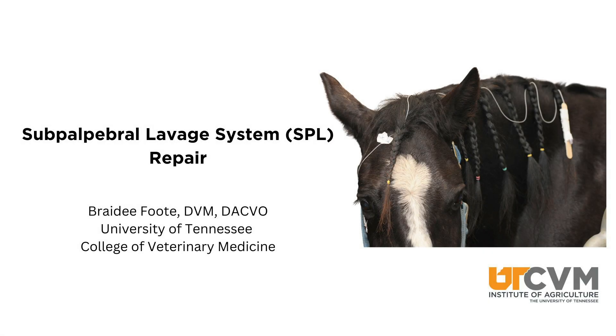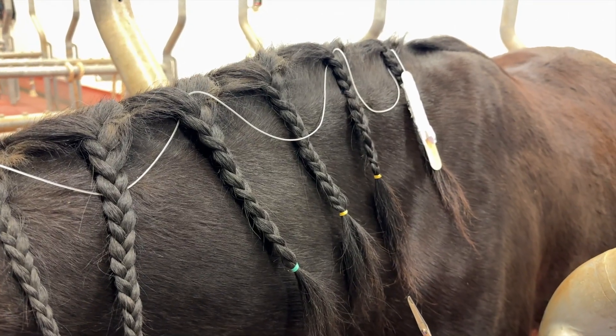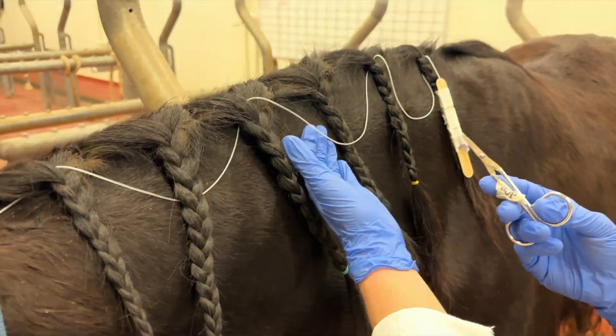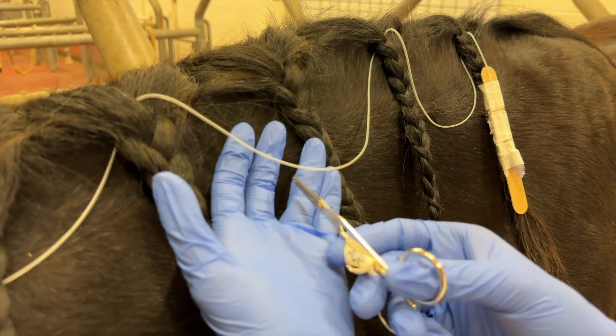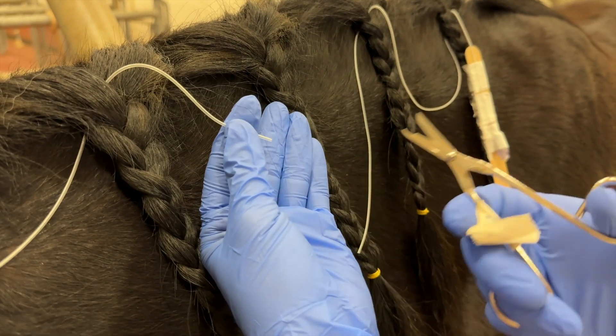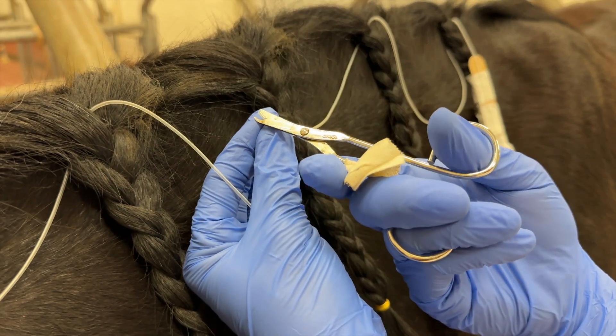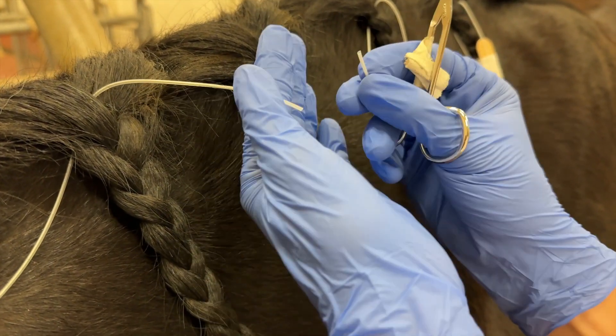This is the sub-palpebral lavage repair. You may need to repair the line if you get a bubble or a hole within the line. You just need a clean pair of scissors and you're going to cut out the damaged portion, but don't cut the whole thing off. You can now splice this together.